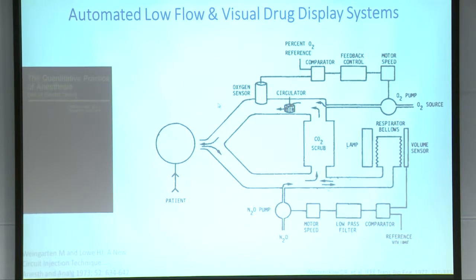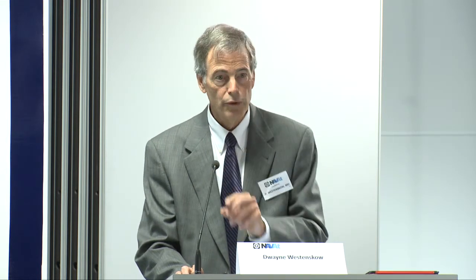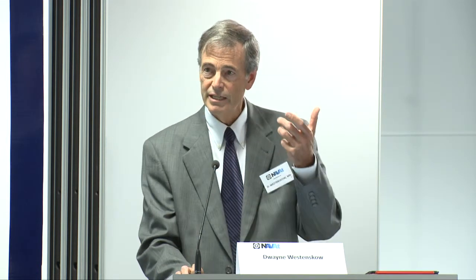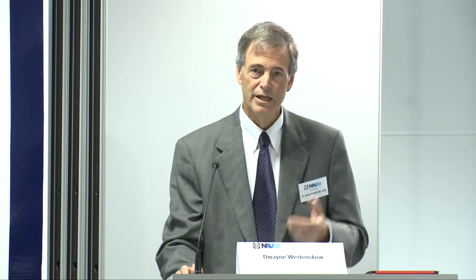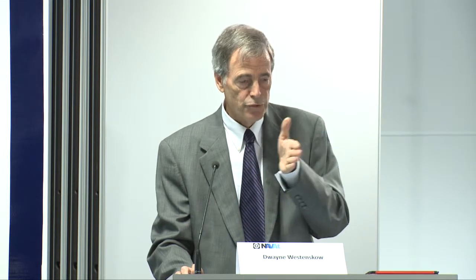And in the practice of closed circuit, as promoted by Harry Lowe especially, the anesthetic agent is introduced via syringe in unit doses based on the patient's weight and requirements. Unit dose is given at each period of the square root of time.